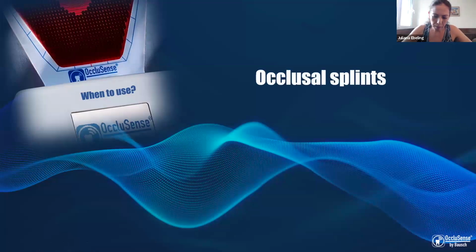Many colleagues ask me, do you use OccluSense to make all the refined adjustments for oral rehabilitation? No, I use papers at the first moment, because with papers I can check the good distribution of the contacts, the place, the interrelation between the teeth.